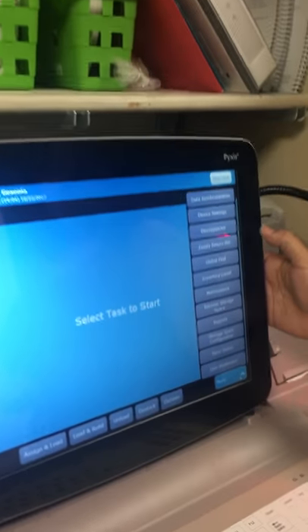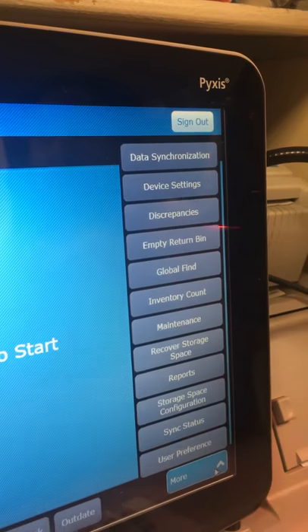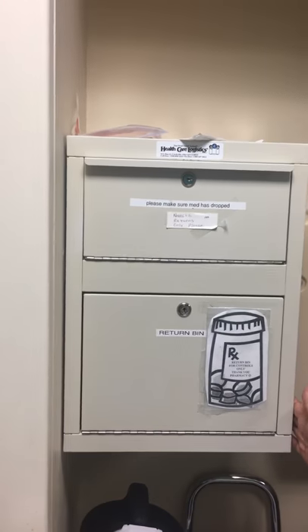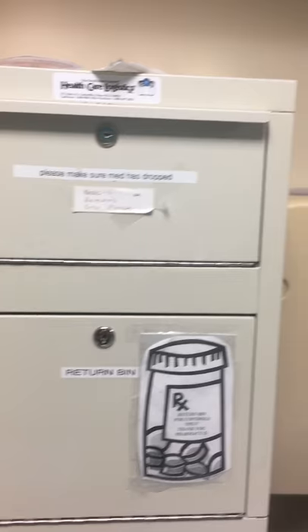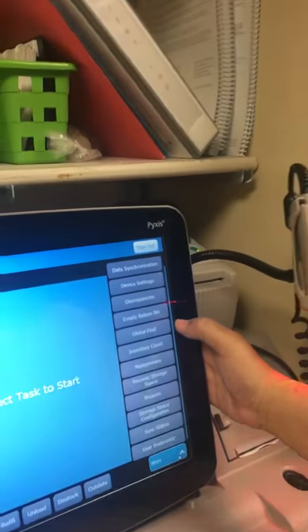Empty return bin is where our nurses will put their narcotic returns when the medication is not given to our patients — they will put it in the return bin, which is only for narcotics. Non-narcotics must be taken down to the pharmacy. Global Find is the option if we don't have the medication inside this Pixis — we can look throughout the whole hospital and go to that nurse's station to get our medication without contacting the pharmacy department.